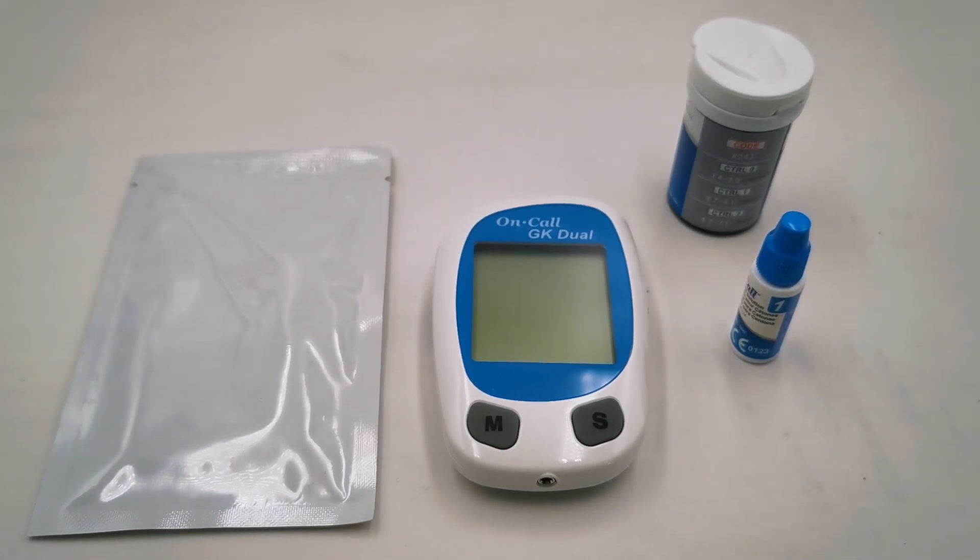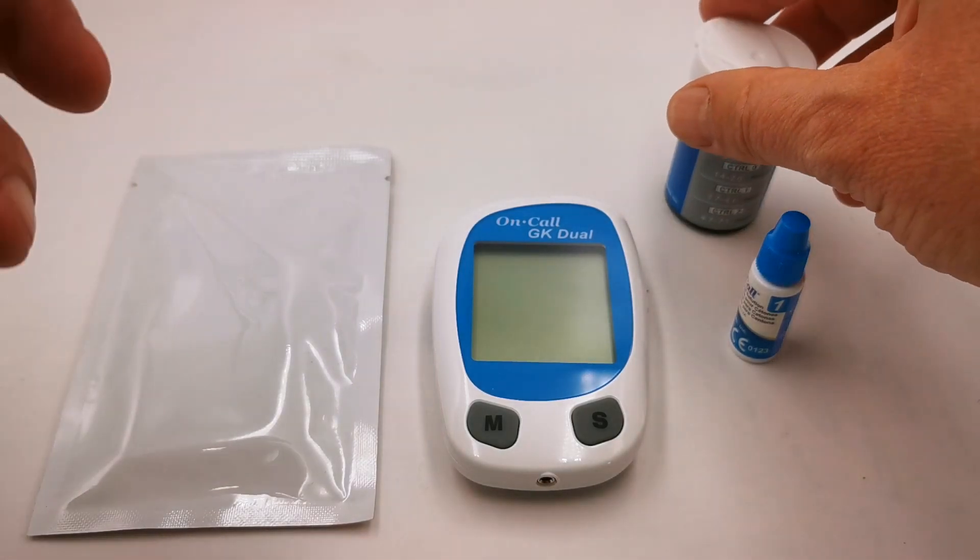Welcome to this ValiumEd presentation video. We're going to show you how to run a control test on the on-call GK meter using the ketone control number one and the ketone test strip.